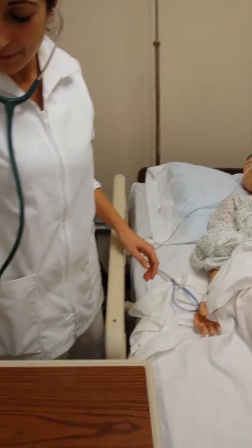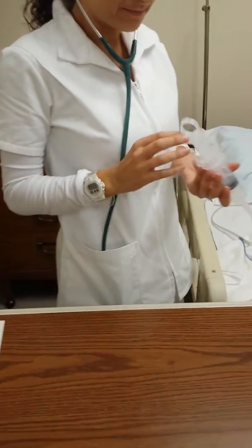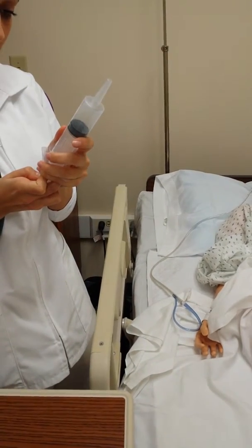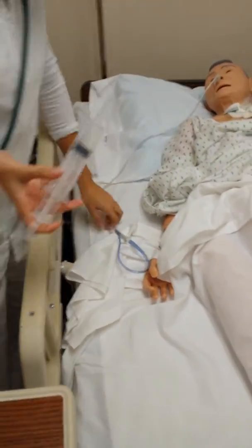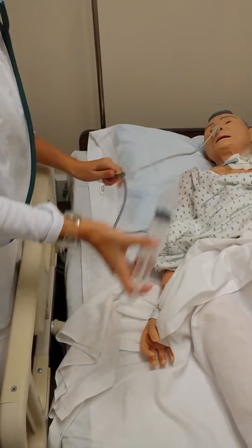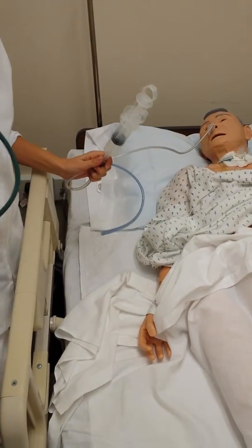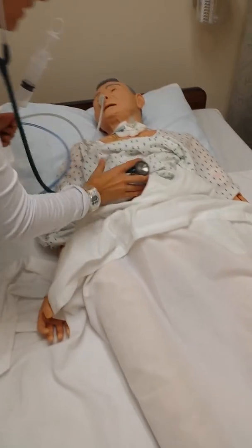Then after we do that, we are going to inject the air. We're going to pull up 20 to 30 cc's of air. Then we're going to clamp the tubing, open it, and put this in. As we're injecting the air, we want to listen by the xiphoid process to make sure that the placement is correct.